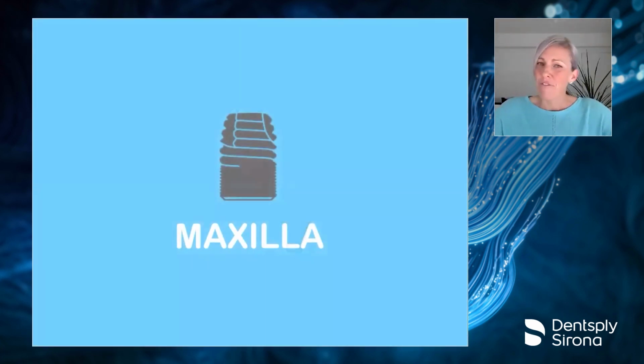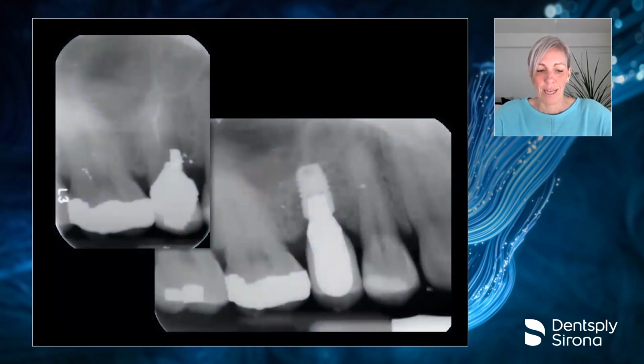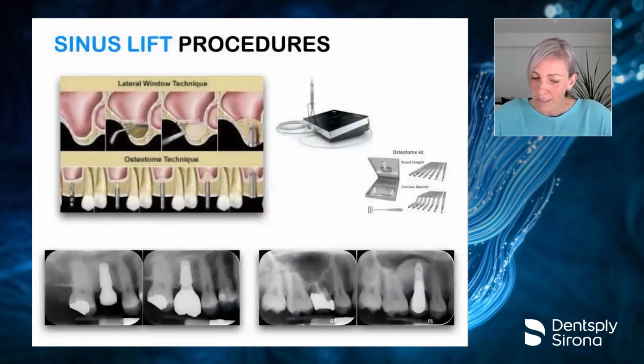So now that you have a big picture of those 6 millimeter implants, let's talk about the indications. Mainly, start with the maxilla indications. You can avoid sinus lift with the 6 millimeter implants, like in this case. But usually in the maxilla, there's less quality bone available. We all know that. And sinus lift procedures, either the lateral window technique or the osteotome technique, are simple. And in my hands, I have almost no complications.